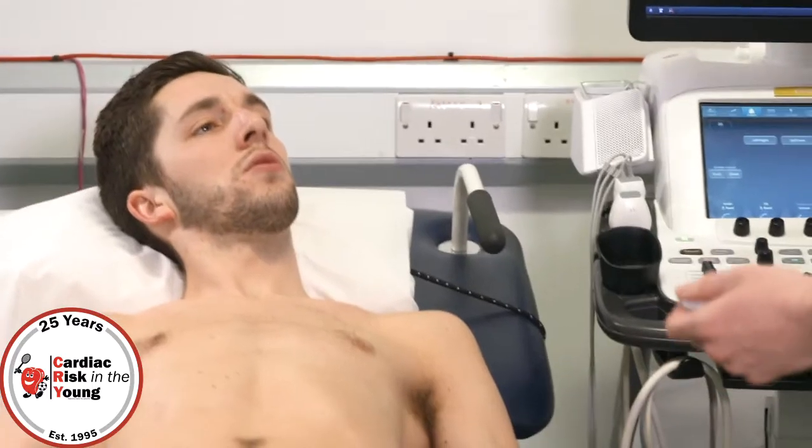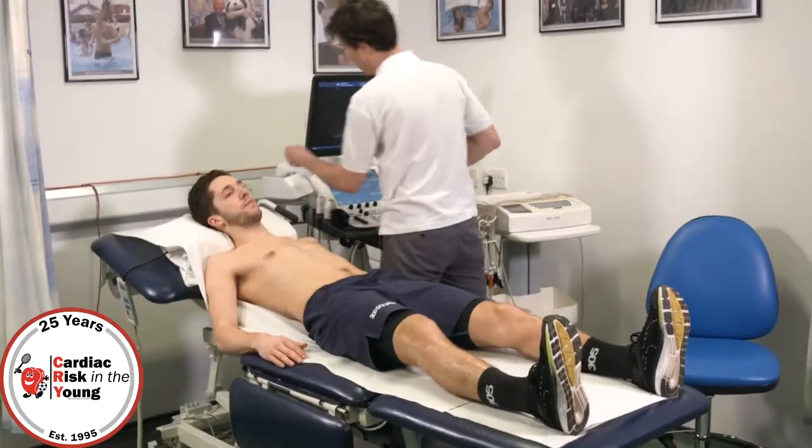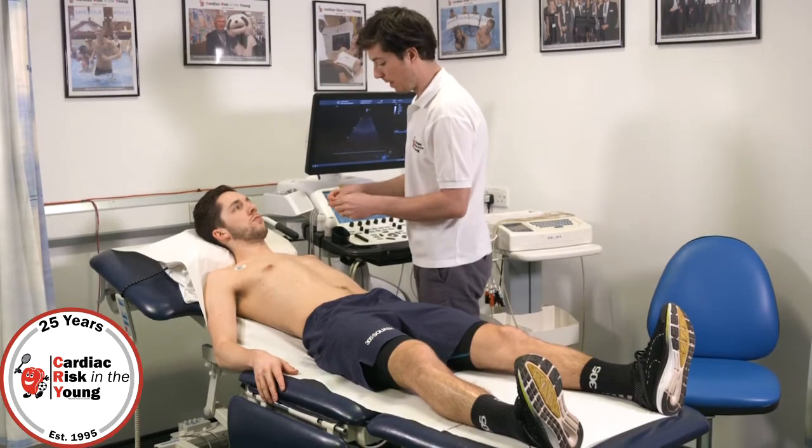Now we're going to do the ultrasound, so we're going to be looking at the structure of the heart, but it will just be directed at your chest, so it's a bit of cold jelly on the chest. And then we're going to get you to roll on your left hand side so you're facing me. So three stickers on here, and then you're going to be picking up your heart rate.